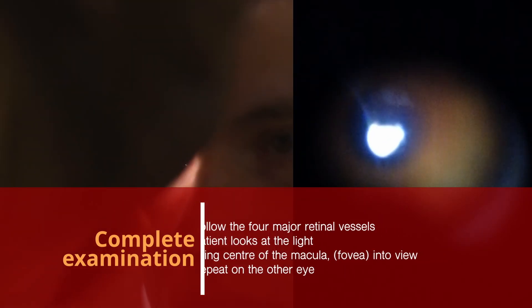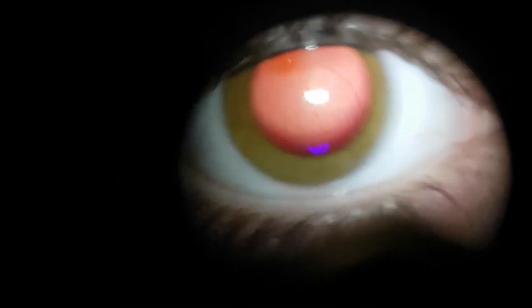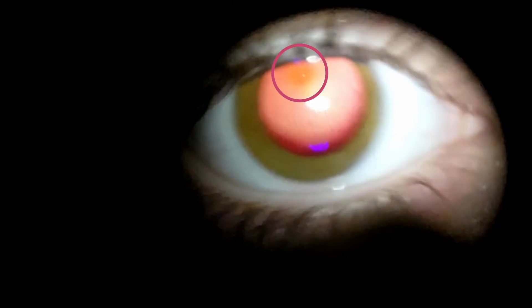In a non-dilated eye, this will cause the pupil to constrict and you will lose the view. In a dilated pupil, the fovea can be seen as a slightly darker zone with a pinpoint reflection.